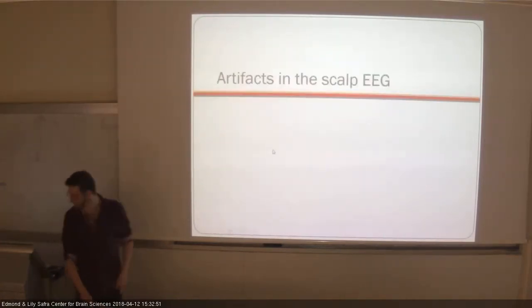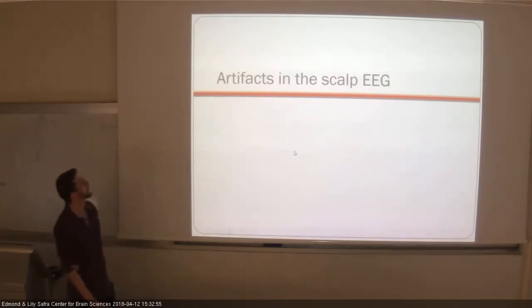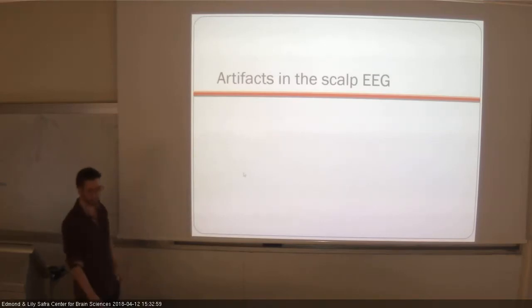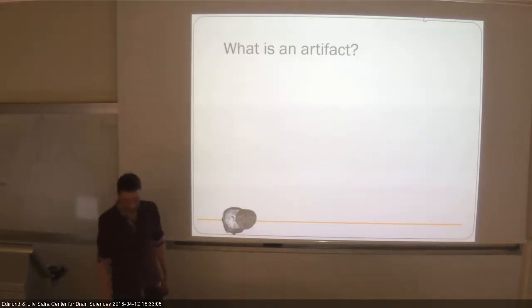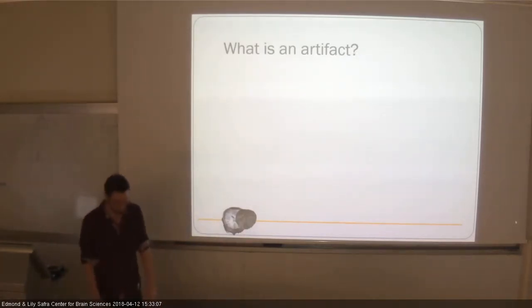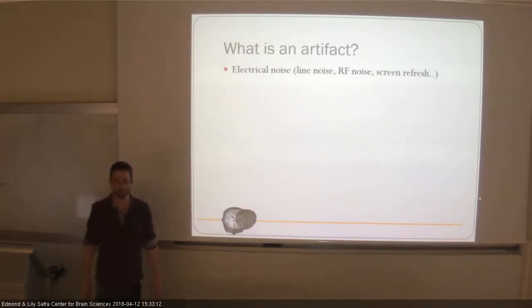All right, very quickly, how much time do I have? 15. Okay, so I want to talk about artifacts, but we're going to be revisiting some of the same ideas in this part as well. Okay, so what are artifacts in EEG?